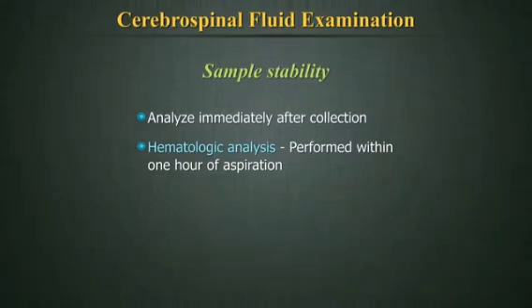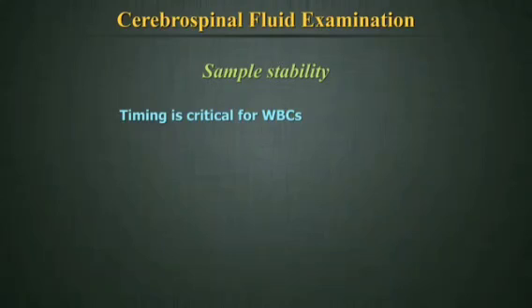Hematologic analysis of CSF samples should be performed within 1 hour of fluid aspiration. Red blood cells and white blood cells have limited stability in CSF because CSF is hypotonic and cells can rapidly lyse.